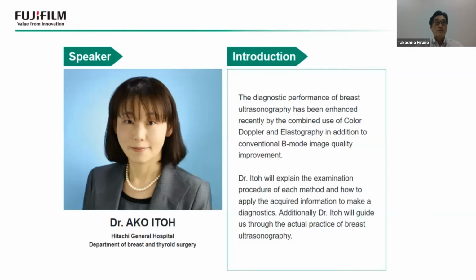Dr. Itoh works in the Department of Breast and Thyroid Surgery in the Hitachi General Hospital, and we were working together to develop our real-time tissue elastography since the beginning. She explains the examination procedure of each method and how to apply the acquired information to make a diagnosis.